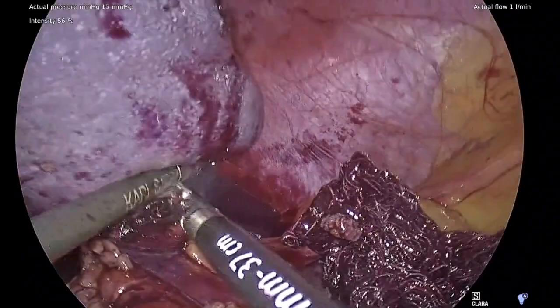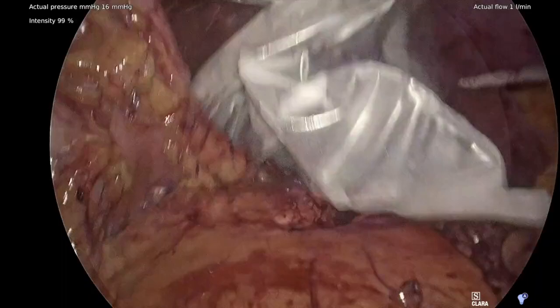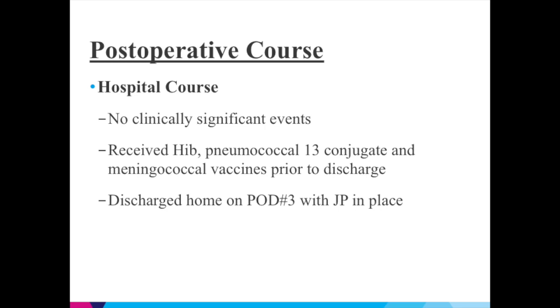The distal pancreas and spleen were placed into two separate endocatch bags and removed from the abdominal cavity. A Jackson Pratt drain was placed within the dissection bed. The patient's hospital course was uneventful and he was discharged home on postoperative day three with the JP drain in place, having received all necessary vaccines.